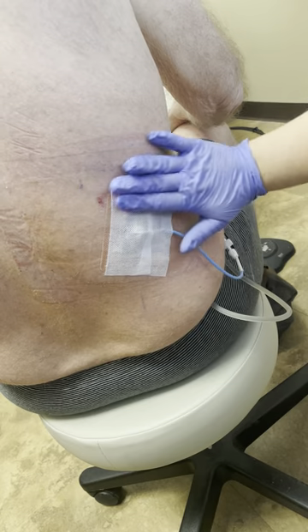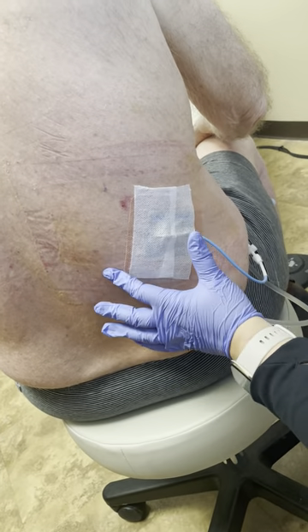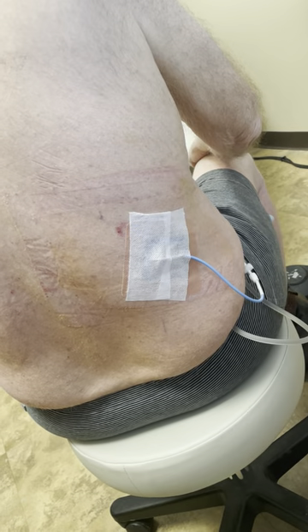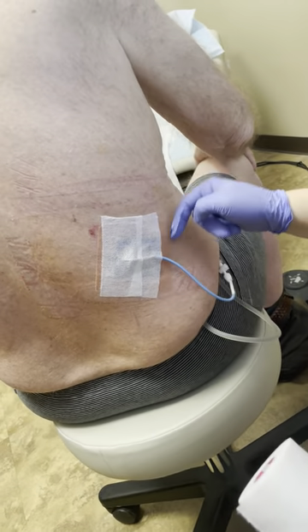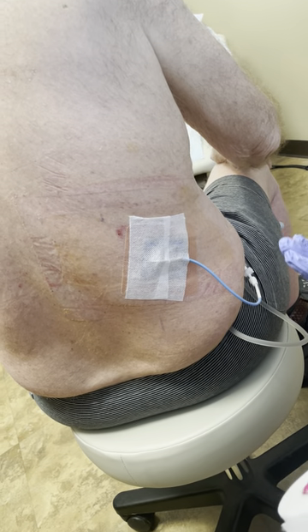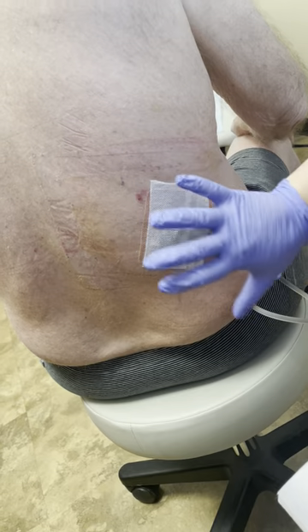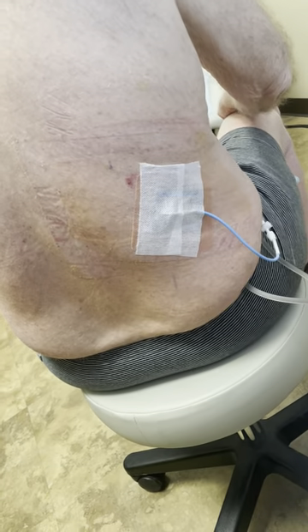And that's all you need to have on. So if you notice some of this starts peeling — if it gets wet or something — you can always just take another one of these and put it on the outer edges. But you don't need any bandages over this at all. That's too much suffocating the skin, and it keeps too much moisture in and will give him an infection.